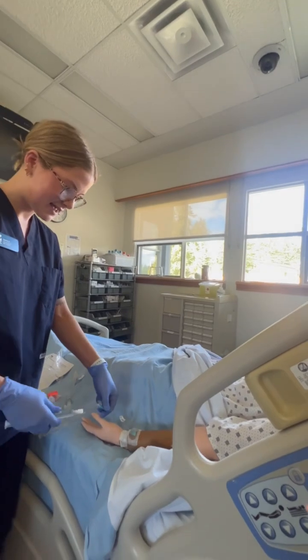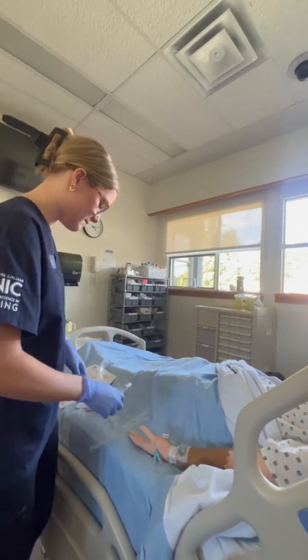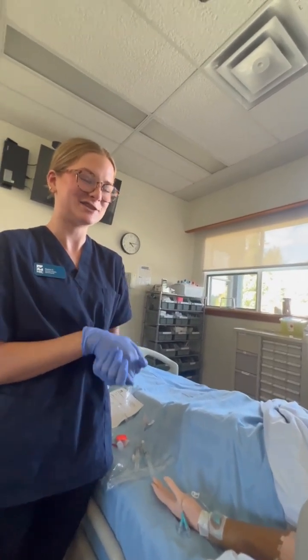All right, and I will leave that here, leaving it clamped. Again, assessing the IV site, ensuring that there is no fluid going interstitial. And I would check on my patient again in 30 minutes to ensure that the pain medication has done its job. Thank you.